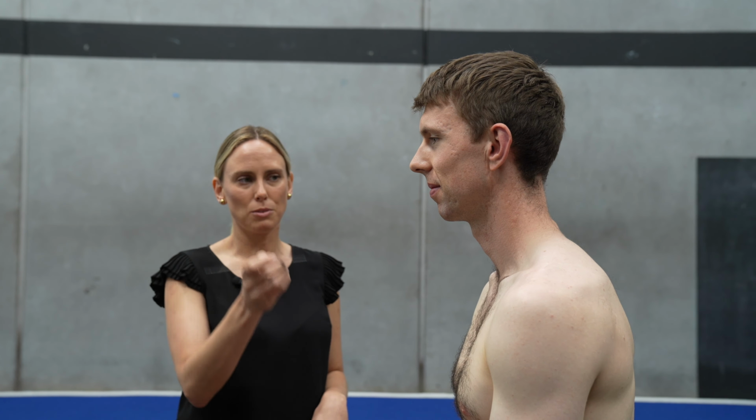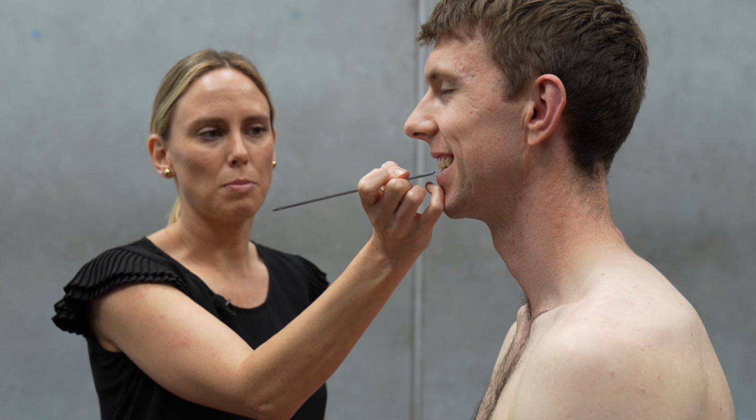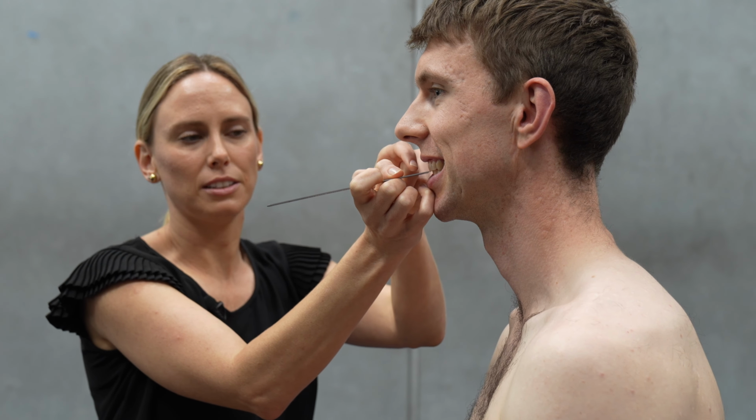If you're a little bit unsure doing these measurements, sometimes it's nice at the start where you line it up and then you can just use a little marker or something like that on this. Make sure you're not drawing on the patient's teeth. So I would just be getting a little marker and just doing a little nick across there, and then I can take it away and measure it.